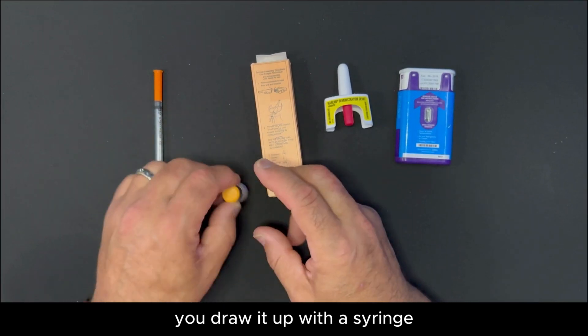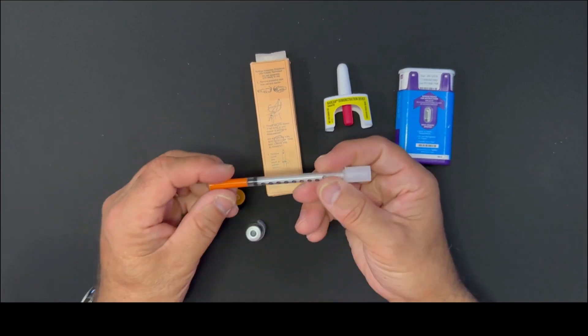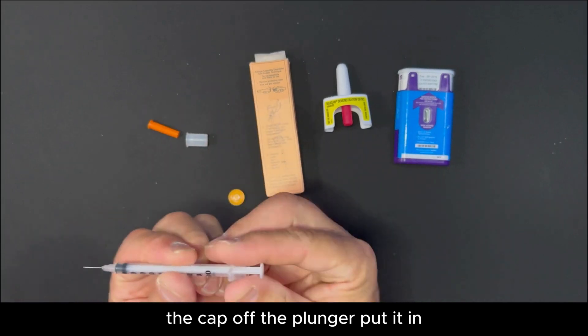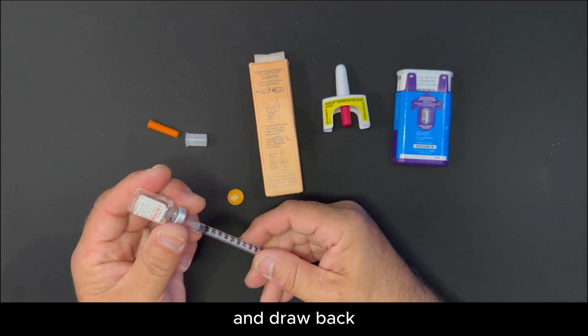You draw it up with a syringe and it's a one shot. Pull the cap off the needle, the cap off the plunger, put it in and draw back.